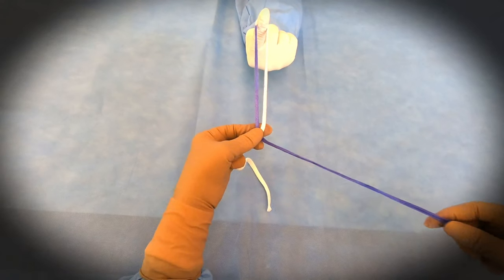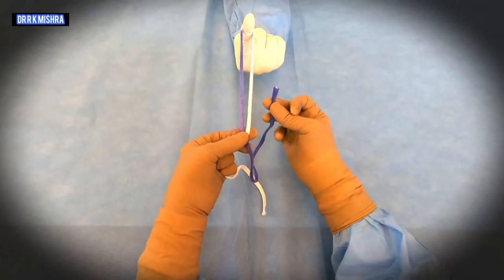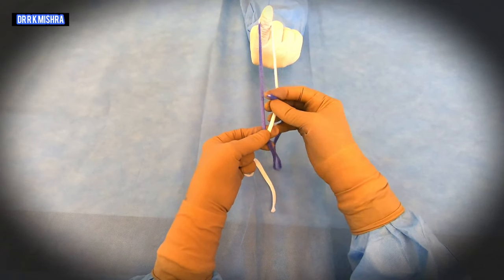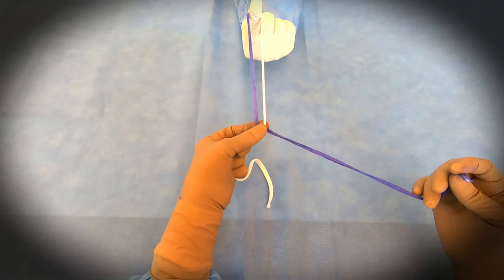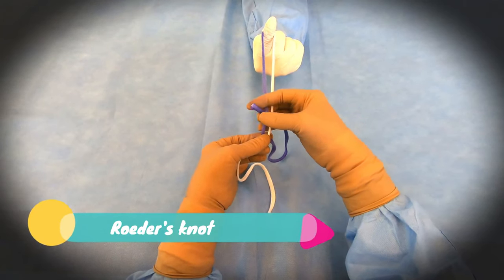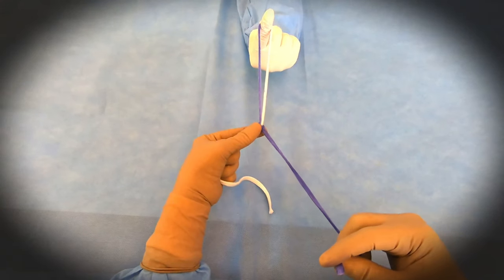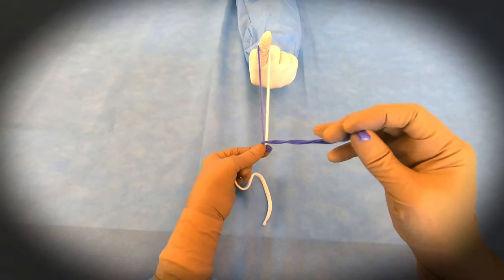Always follow the principle of going from below up — you will go in between and take a single hitch. The single hitch will be taken first; this is the single hitch. After that you will take three winds — wind means wrapping around both limbs. This is the first wind, followed by the second wind.